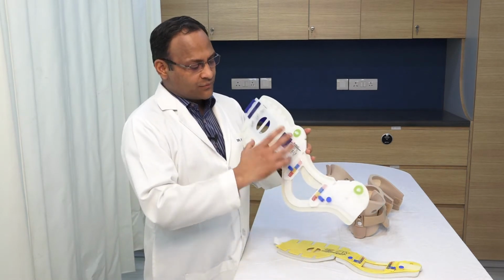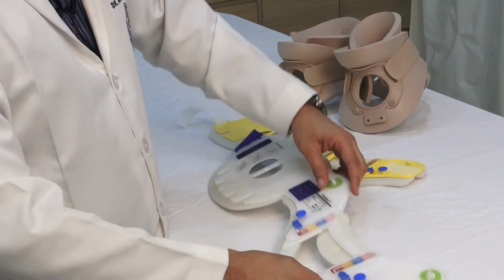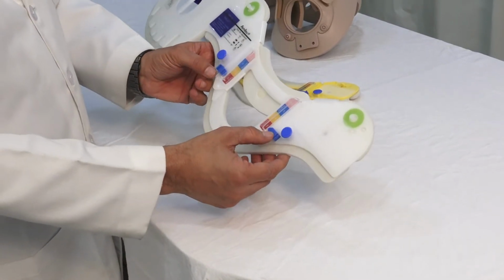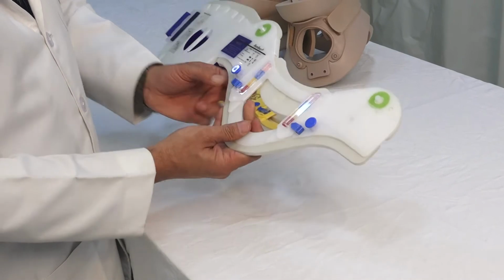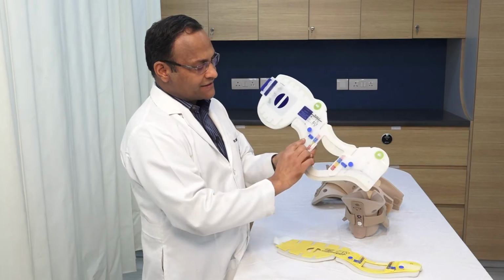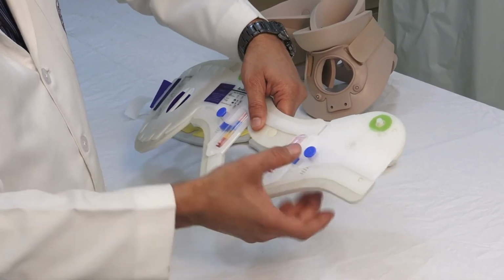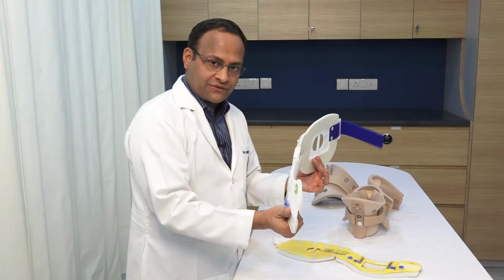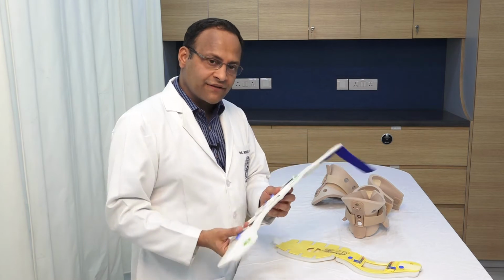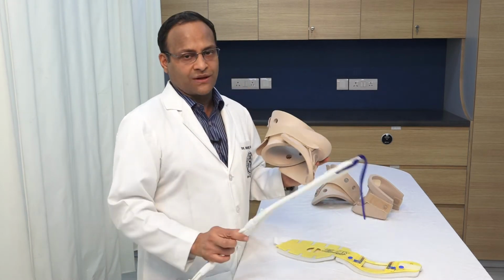Now if we require a larger size, there are two locks in it. We have to pull these locks apart. There are two keys which need to be pushed backwards, and then it is adjusted depending on the length of the neck. It is adjusted, and suppose it fits in here. Now these keys go in and it is then locked. Now this collar can be used. Subsequently, we'll demonstrate how to apply these cervical collars, the one which comes with the prefixed size and the adjustable ones.